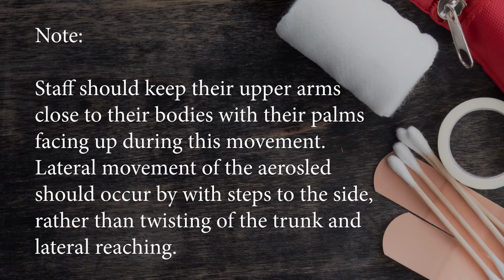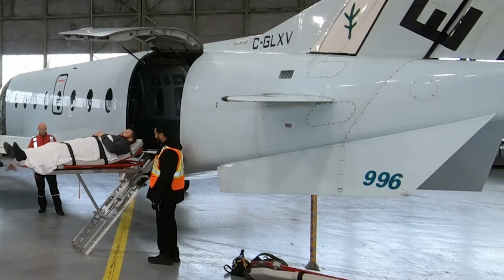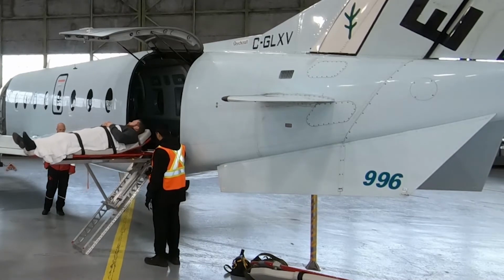Note: staff should keep their upper arms close to their bodies, with their palms facing up during this movement. Lateral movement of the aerosled should occur with steps to the side, rather than twisting of the trunk and lateral reaching. 9. Once the aerosled is fully on the lift platform and locked in place, one of the pilots will raise the mechanical lift platform.